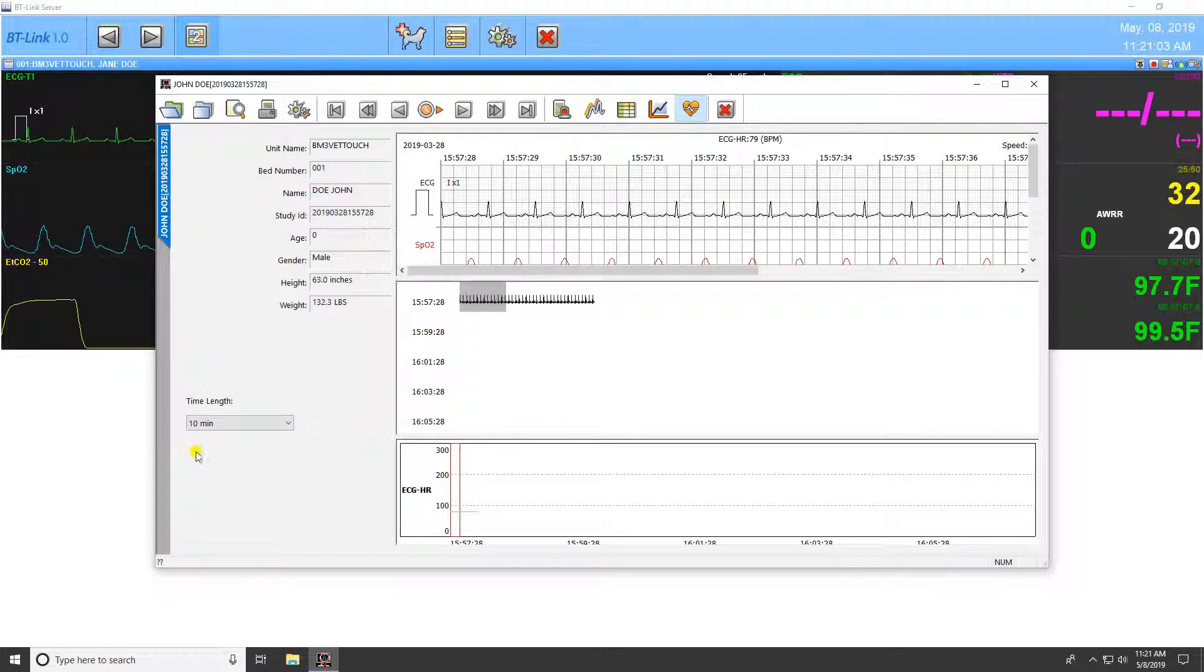Many of these views allow you to select the length of time displayed for the currently selected study by changing it in the bottom left-hand corner.